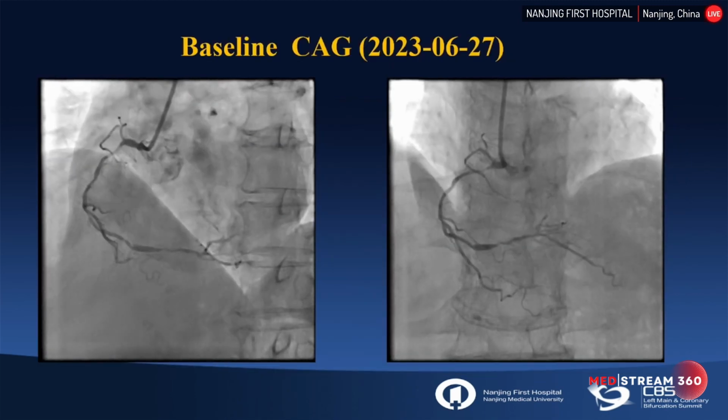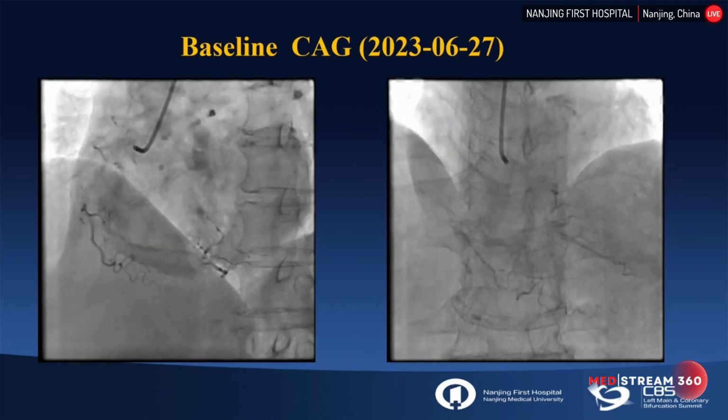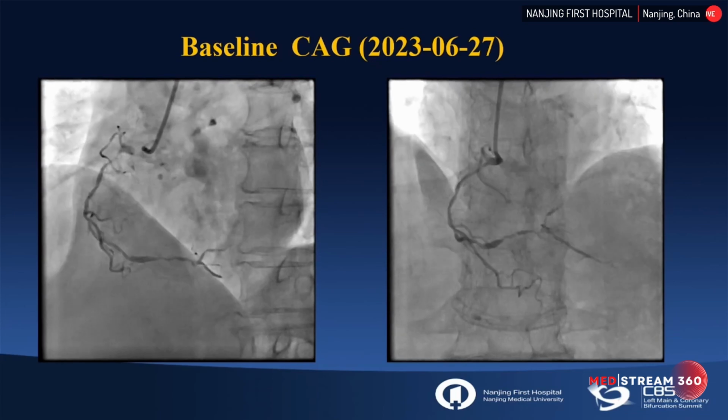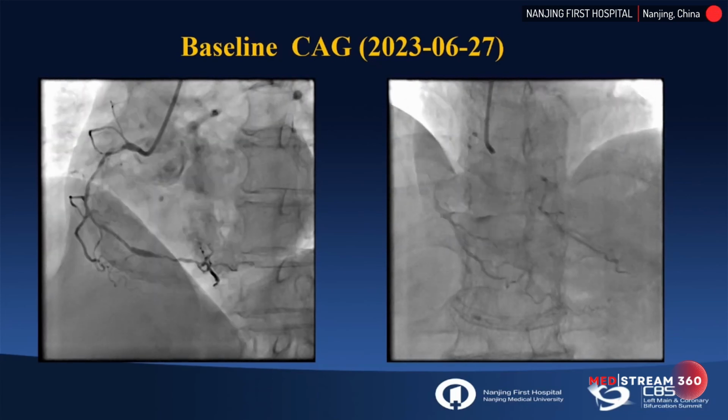From the LAO cranial position, we show the RCA is diffusely diseased with a serious narrow lesion.